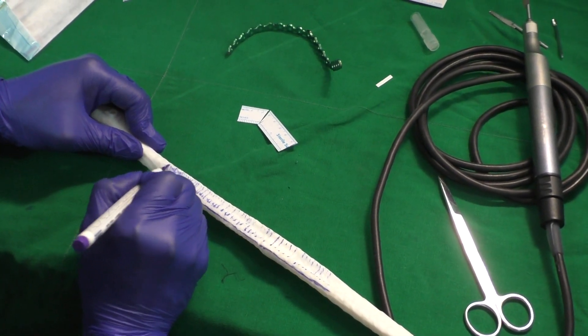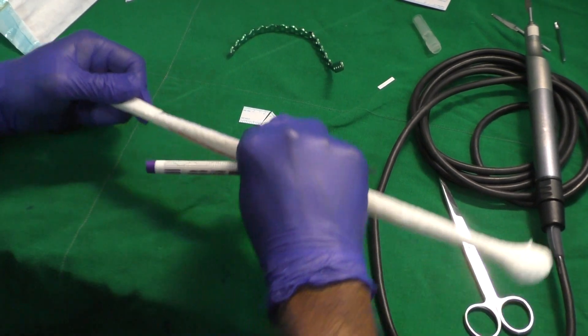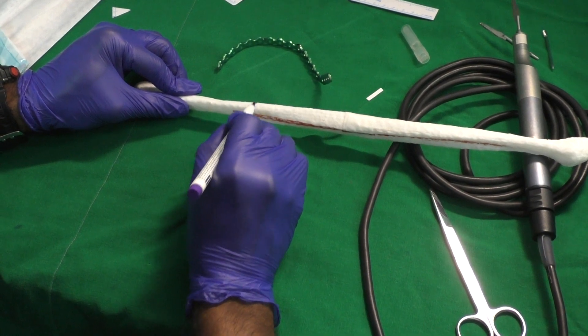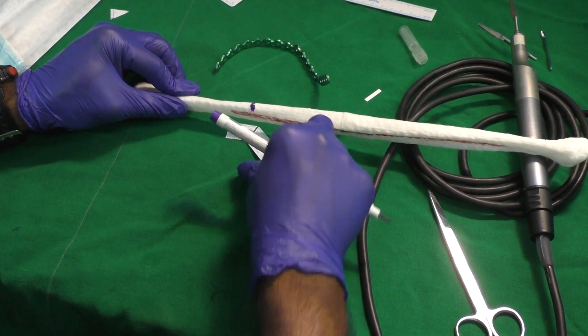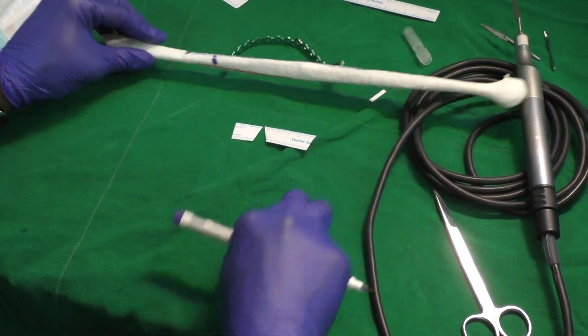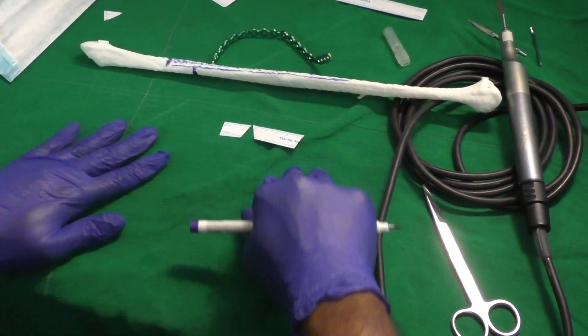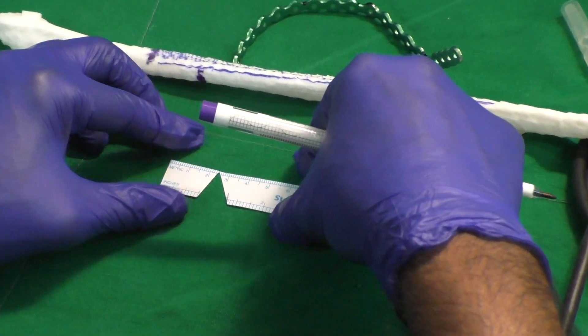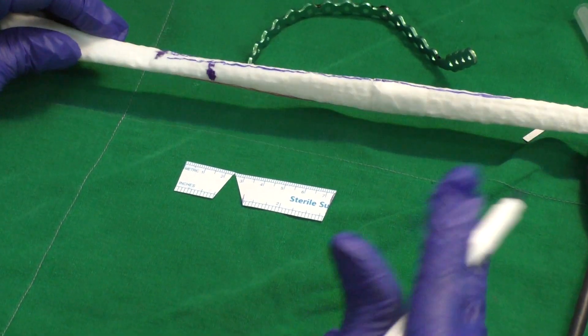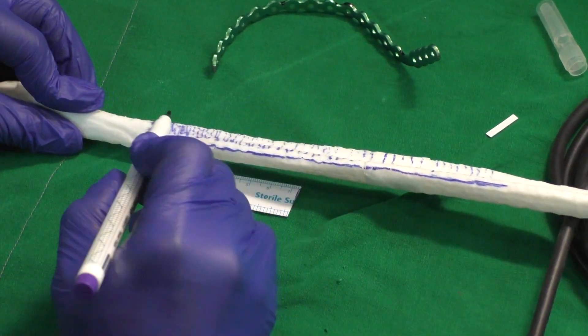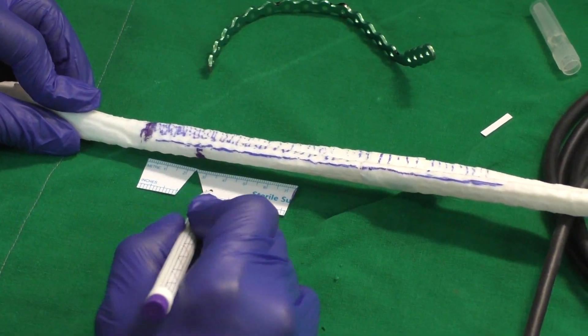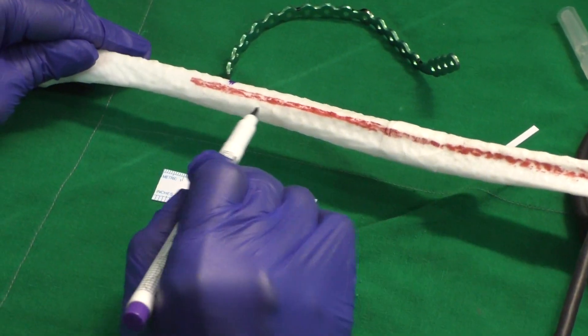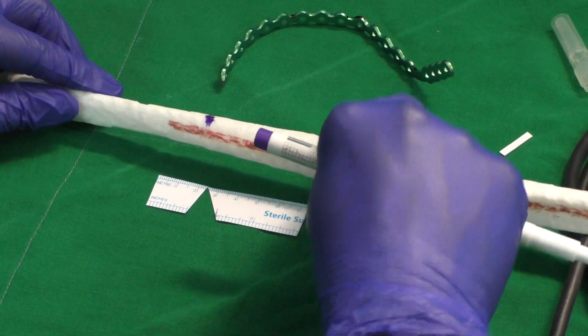We generally leave six centimeters of the distal fibula without disturbing it, and then now using the paper scale as a template, the length of the segment that's required is marked at the distal end of the fibula. The paper scale is taken out and the bits are straightened to expose the complete extent of the osteotomy. Now we must understand that this osteotomy has to be replicated at the base of the fibula, meaning just distal to the pedicle.